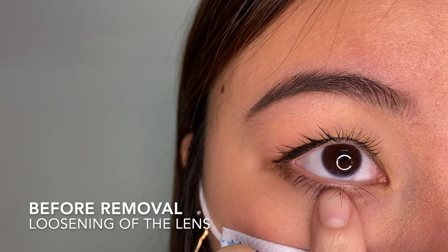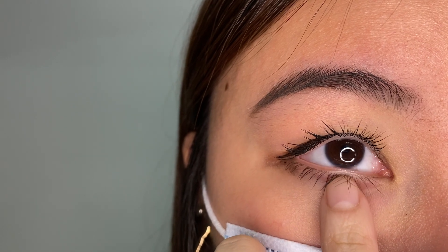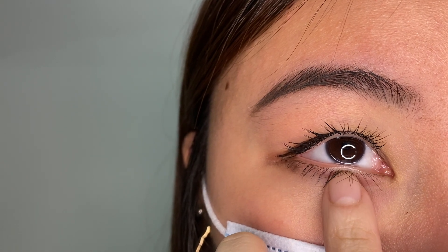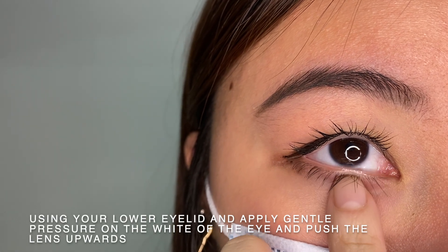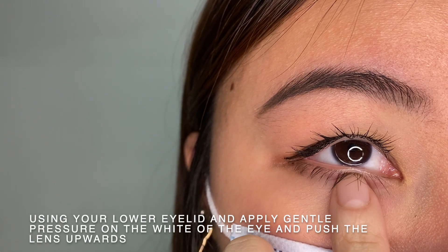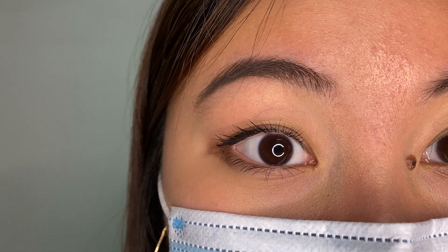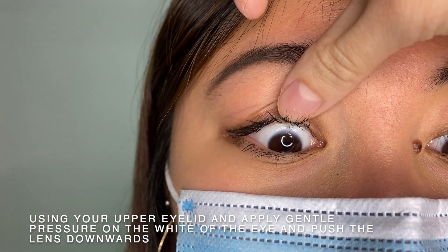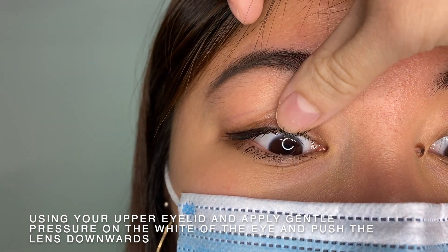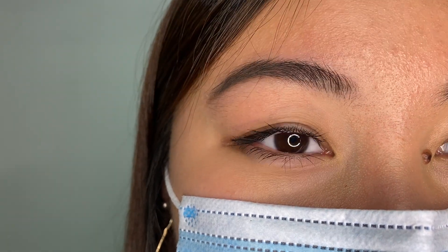Loosening is important prior to removal. This is to make sure that the lens is not stuck onto your eyes when you remove them. All you need to do is, using your lower eyelid, apply gentle pressure on the white of your eye and push the lens upwards. Then, using your upper eyelid, apply gentle pressure on the white of the eye and push the lens downwards. This will help loosen the suction and as you blink, you will be able to feel the lens move.